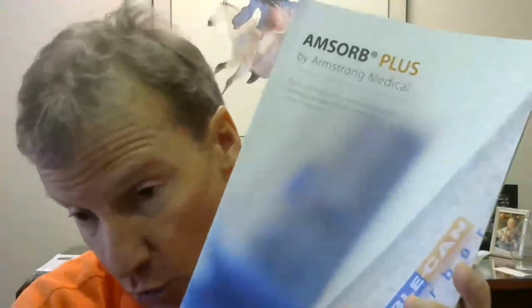So you just say, when do you change your absorbent? Are you changing it based on color change? And then you would ask, they say, yeah, when it turns a little purple, we change it. You might ask them, are you changing it at half color, a third color, a fourth color, and get an indication of what they're trying to do.